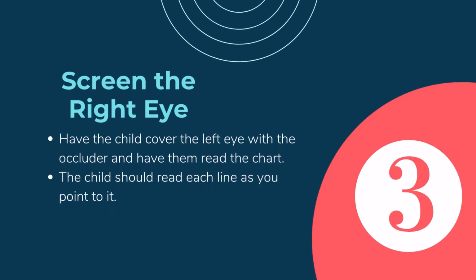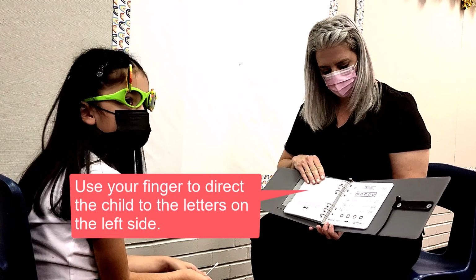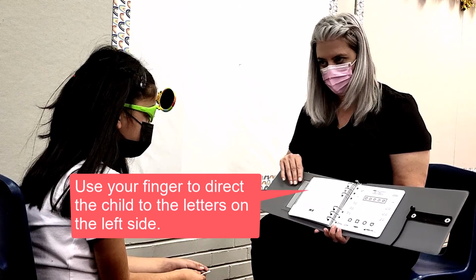Begin screening the right eye by having the child place the occluder over their left eye. Using a pointer or your finger, direct them to the line they will read. The child may need assistance with proper use of the occluder.